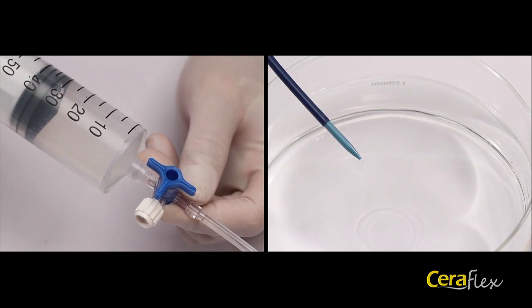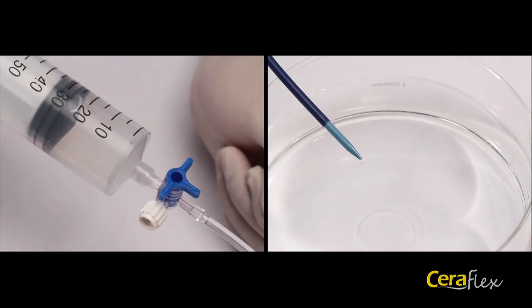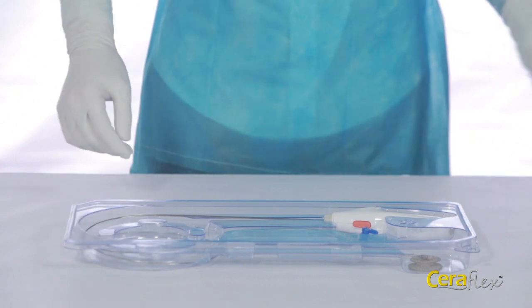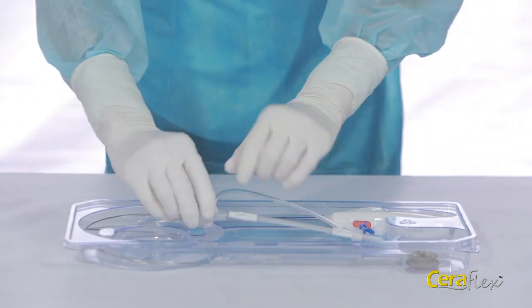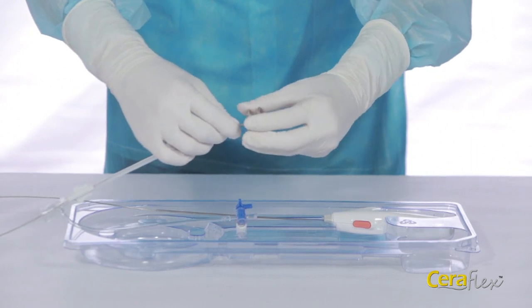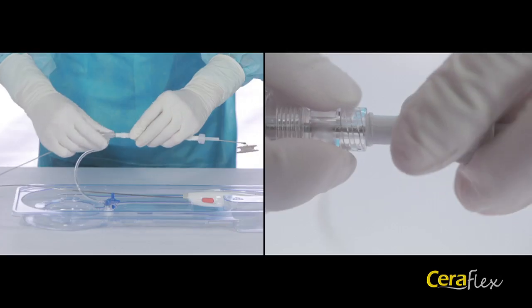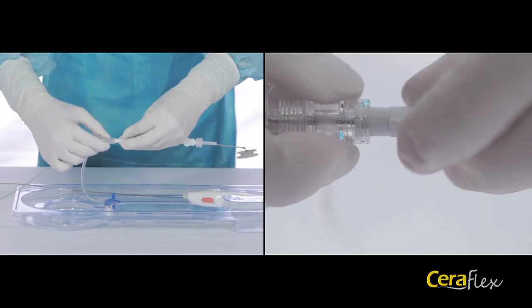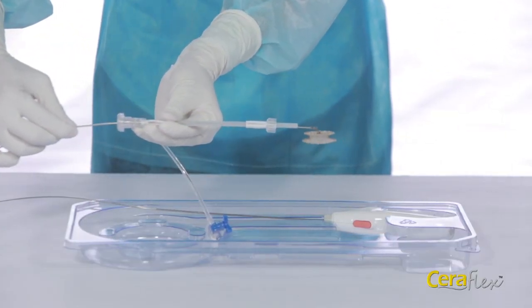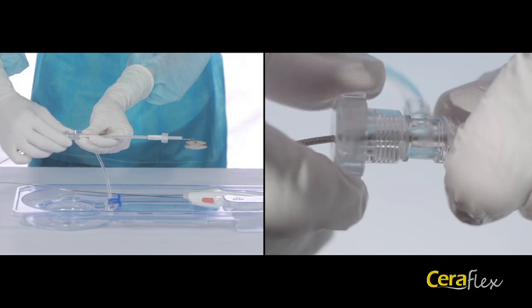To start preparation, flush the dilator and sheath with saline solution. Each Seriflex occluder package contains a pre-mounted occluder and delivery cable, hemostatic valve, loader, and handle. Carefully check to ensure the connection between the occluder and the delivery cable. Screw the loader into the hemostatic valve clockwise.